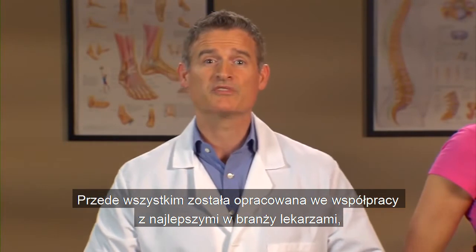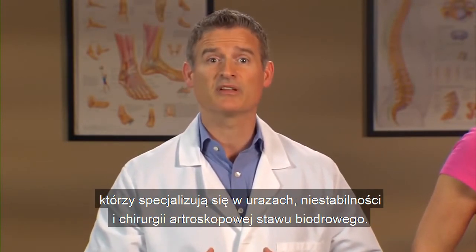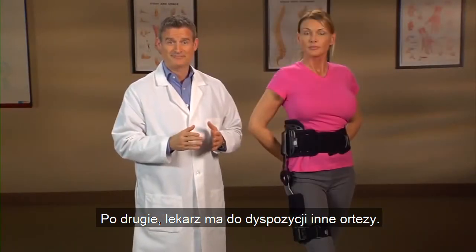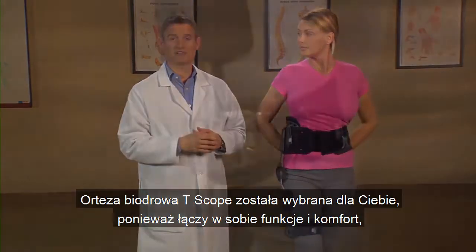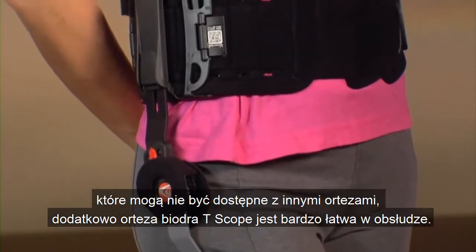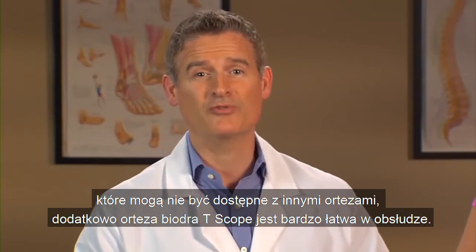First of all, it was developed in conjunction with industry-leading doctors who specialize in injuries, instabilities, and arthroscopic surgery to the hip. Second, there are other hip braces available to your doctor. The T-Scope hip brace was selected for you because it combines the function and comfort that may not be available with other braces. And the T-Scope hip brace is very user-friendly.